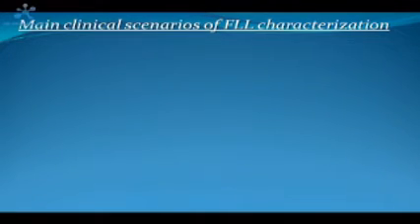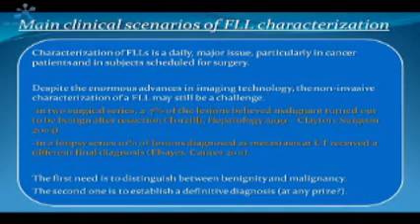You see these very recent studies where a number of lesions believed malignant otherwise turned out to be benign after resection, or in this other series from the USA, from the MD Anderson Center, 10% of the lesions which were thought to be metastases at CT in the end turned out to have a different final diagnosis at biopsy. So even today there is a problem of a non-invasive characterization of focal liver lesion.